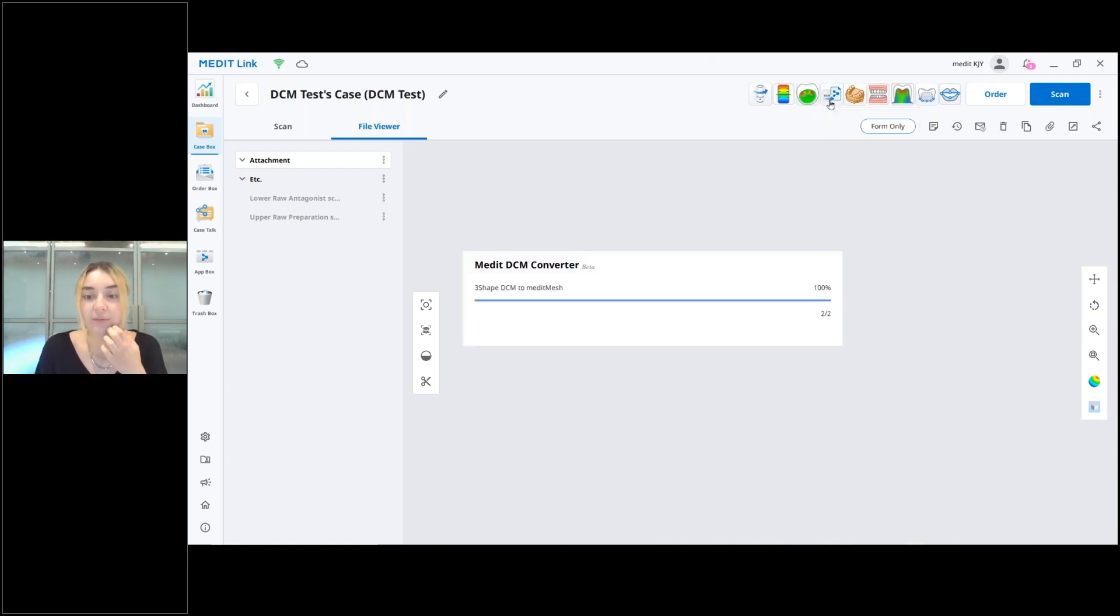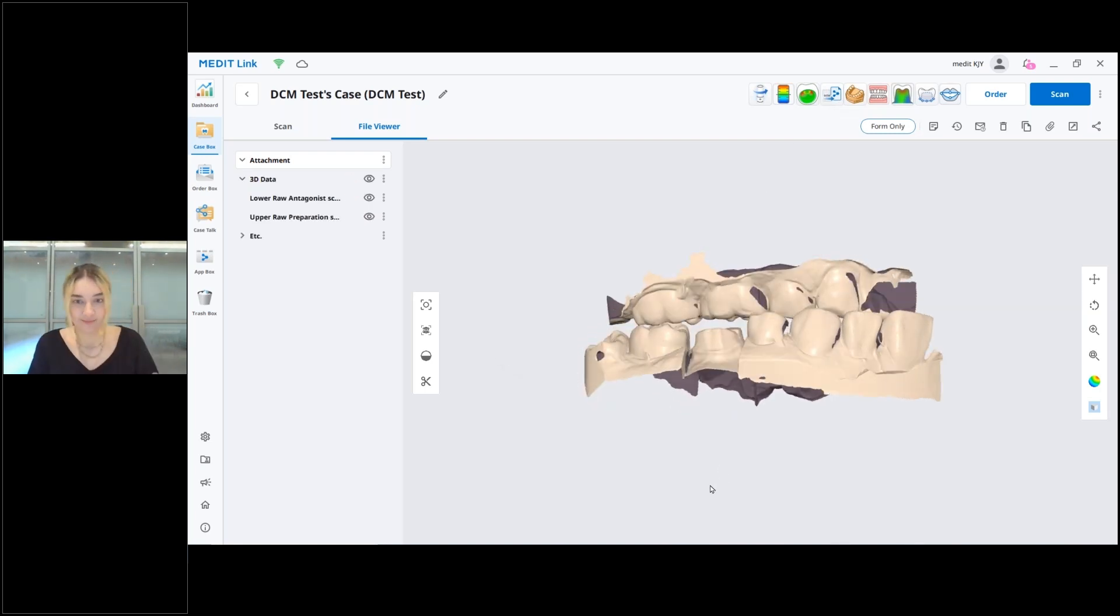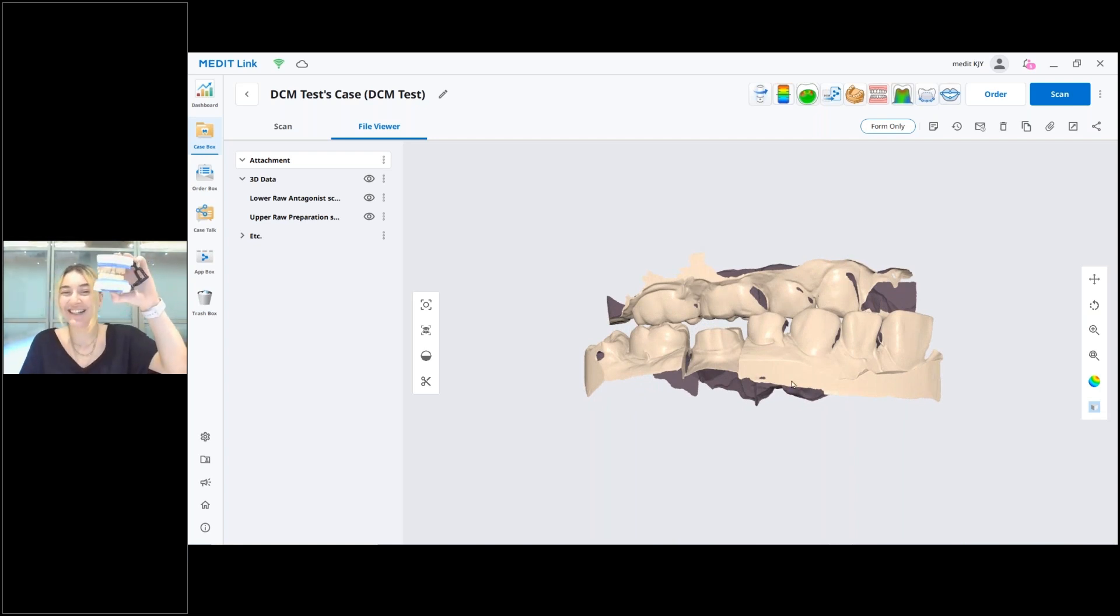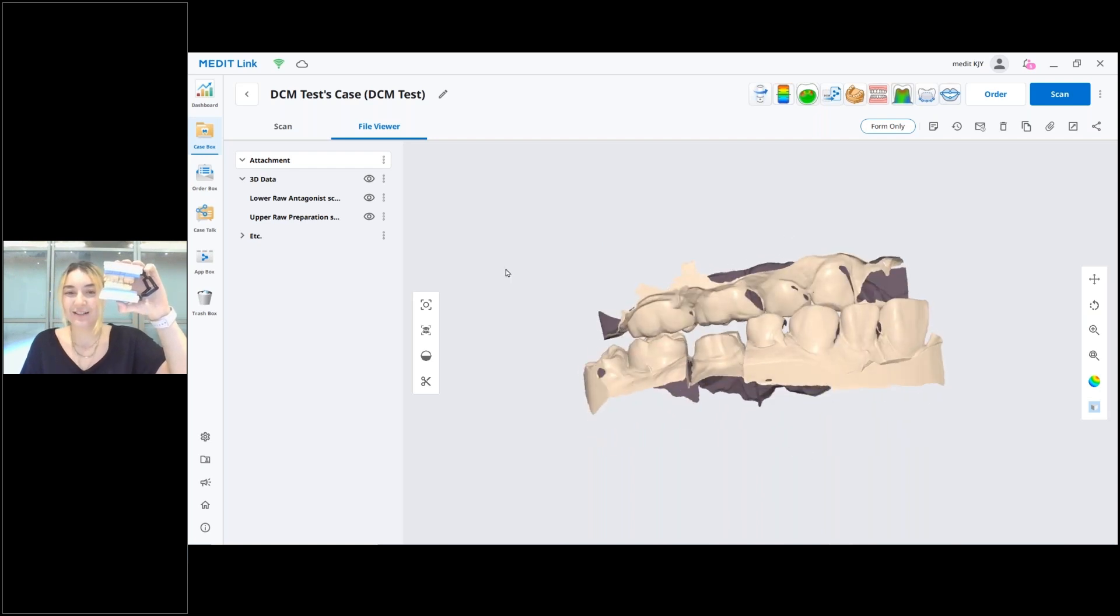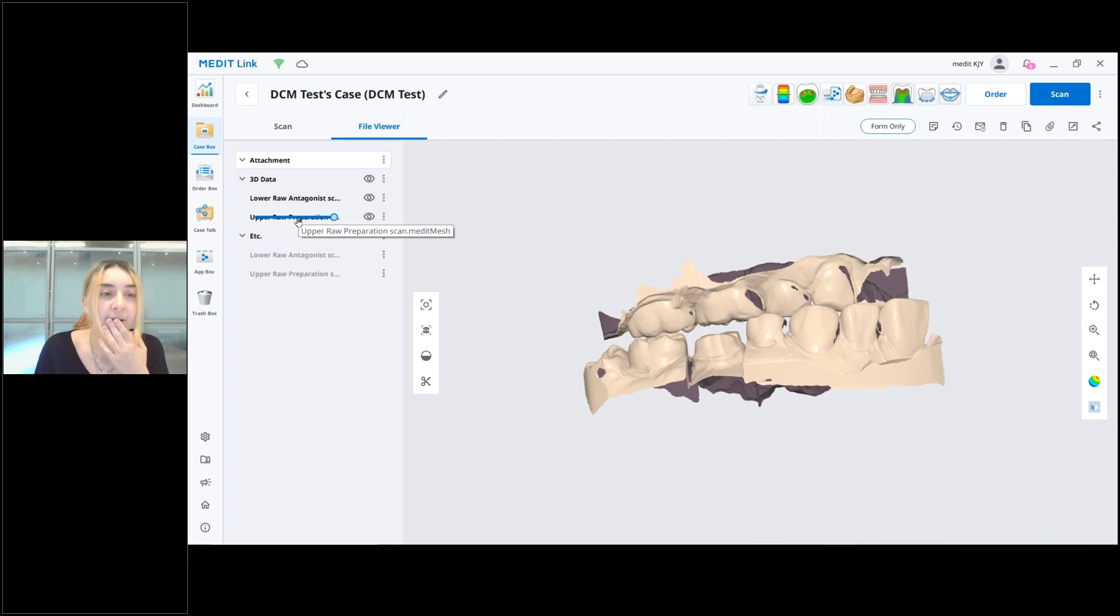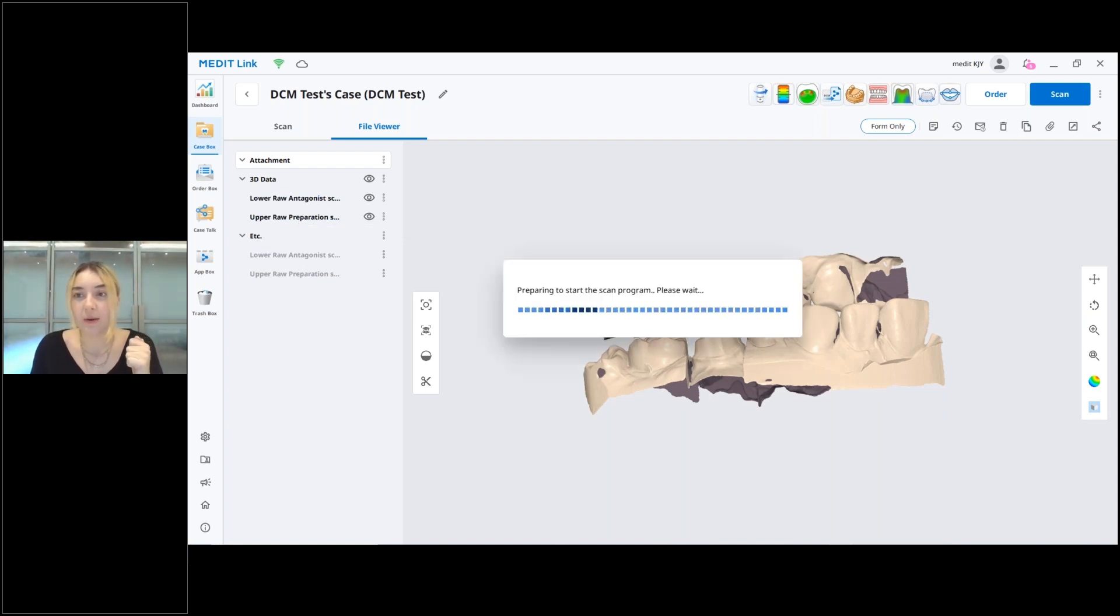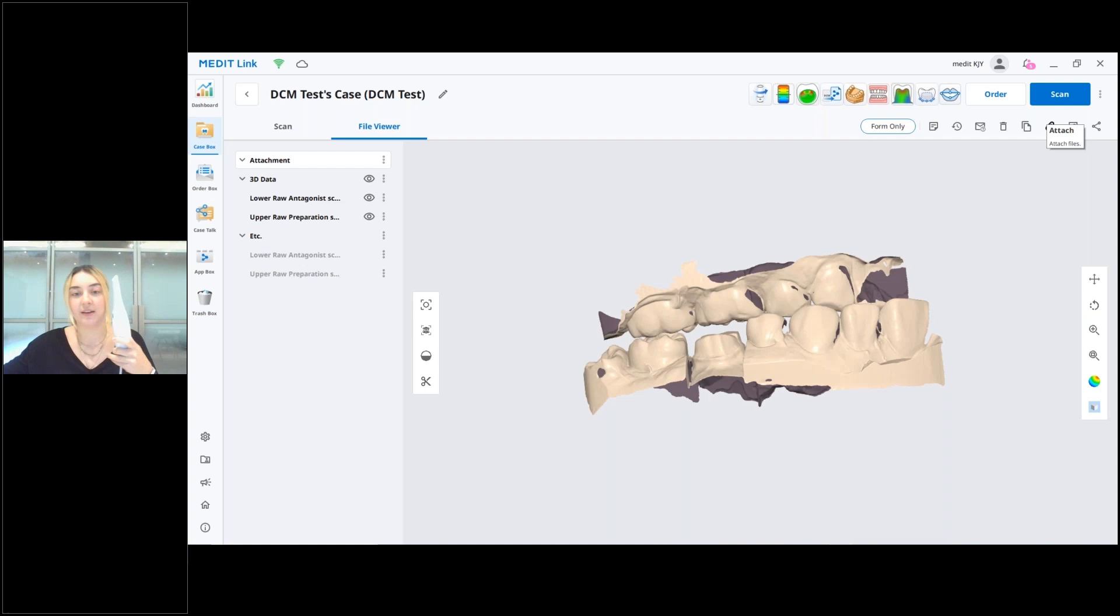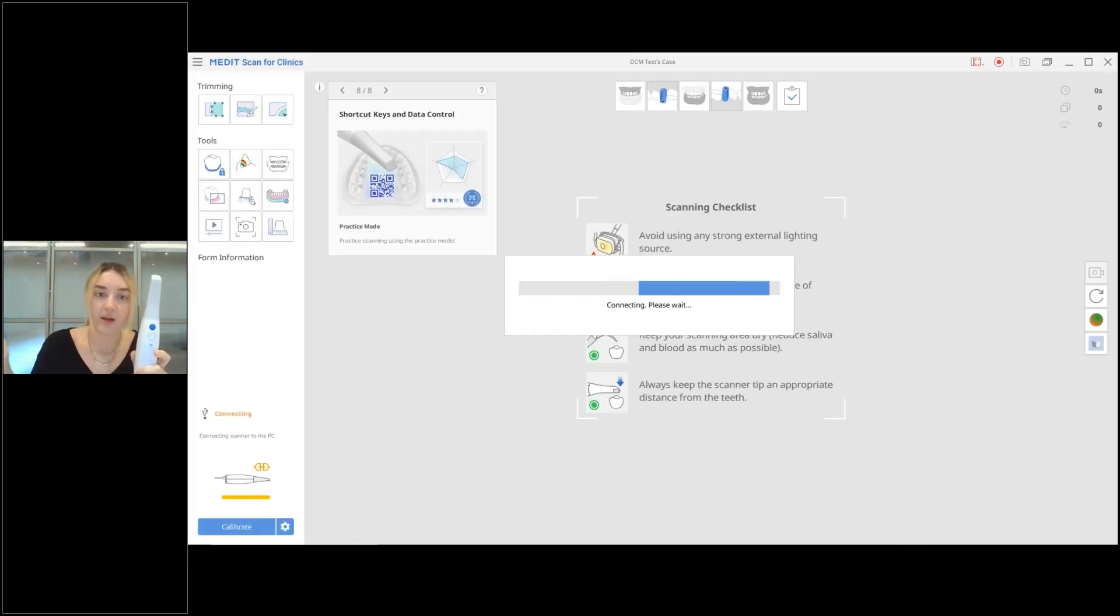I just attached the files and as you can see they're here in the file viewer but they're under attachment category. As you see, even if I click on them it shows me that this type of file cannot be previewed. Here I have those files and now I click this button which is the button for DCM Converter. And yeah, here I have them. It's just that simple. When is anything in life that simple? Well now I have those files here as DCM files and then I have them here in Medit mesh format.